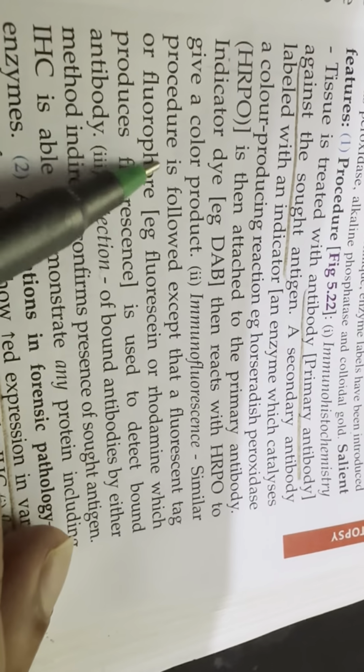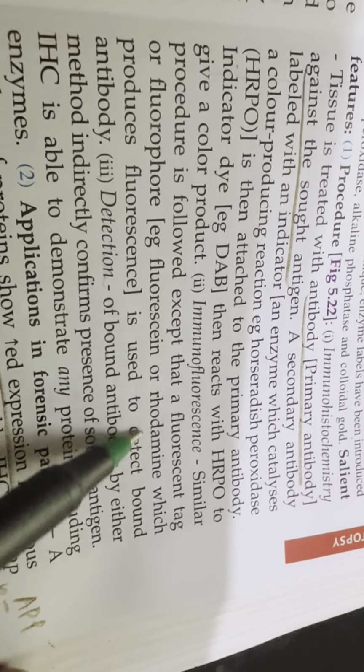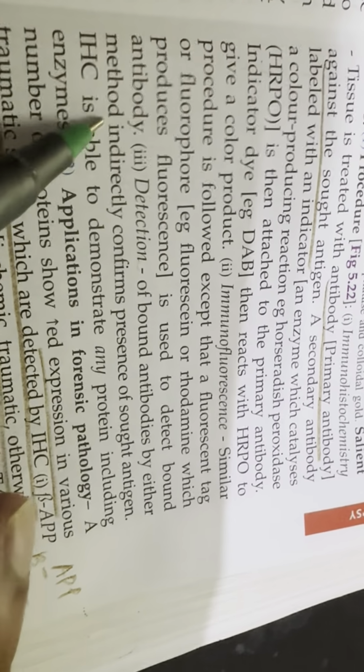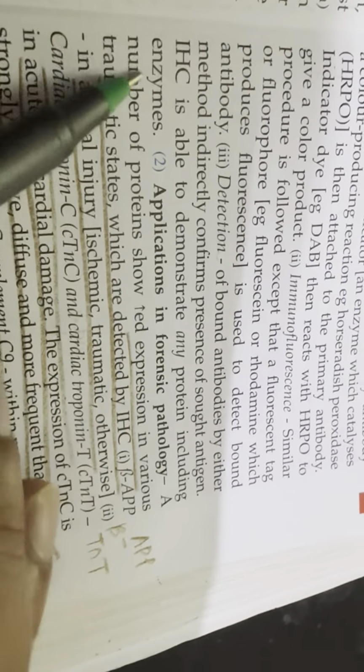In immunofluorescence, a similar procedure is followed except that a fluorescent tag or fluorophore, such as fluorescein and rhodamine, which produce fluorescence, is used to detect bound antibody. Detection of bound antibody by either method indirectly confirms the presence of the sought antigen. Immunohistochemistry is able to demonstrate any protein including enzymes.